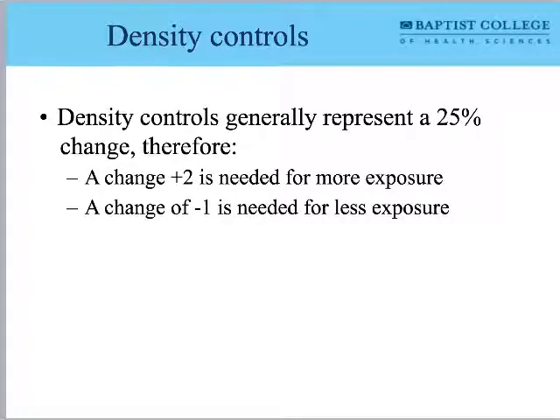Now sometimes, since we're talking about density, as darkness or blackness on the image, there is a flip side that we sometimes talk about in digital, and we'll come back to it in just a minute, but we may refer to brightness. Brightness is actually something we can measure as well with the digital system. So brightness on radiography refers to underexposure.